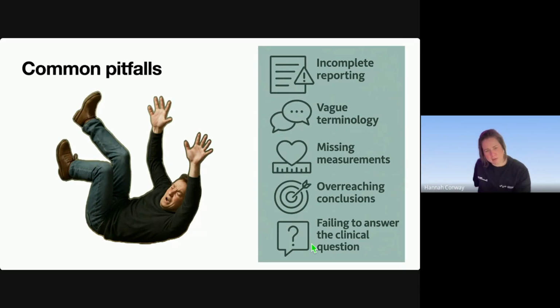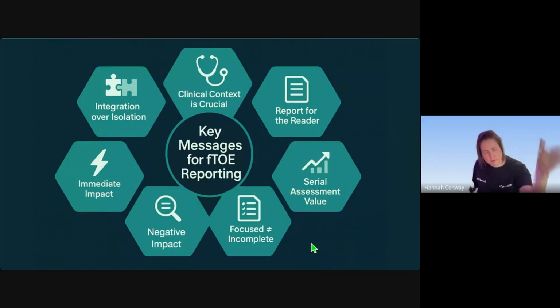And I think what I'd said earlier is summarised in this one slide, with the most important thing being that you need to integrate across the scan. So it's important not just to make one decision based on one view. Even though TOE has far superior resolution, you still need to correlate your findings across different views. You always need to apply clinical context.